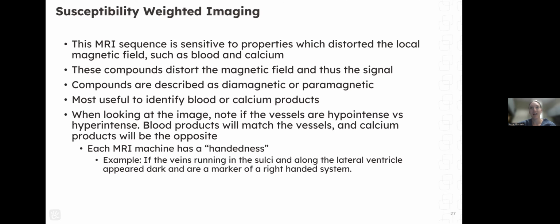So you don't really need to know much about that. Just if you're looking at an image, take a look at the vessels, because it'll be helpful to you to look and see if you're actually looking at blood or calcium. Just a little play on words.